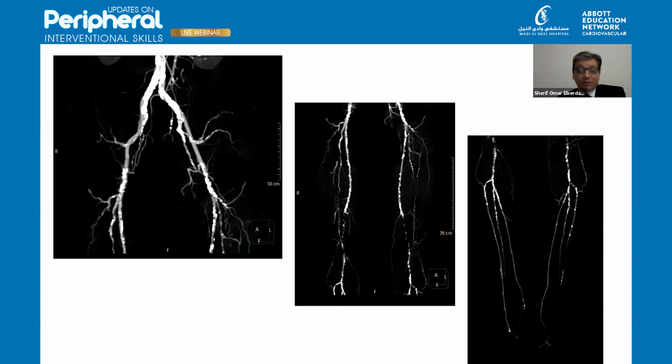Regarding the transbrachial approach, mainly the transradial approach in our intervention is not that applicable, especially for distal SFA and P1 segment, because we don't have such long tools to go through a transradial approach. But the transbrachial approach is very applicable, and we use it a lot in this kind of situation. But regarding this kind of patient, who had a CABG, a left transbrachial approach is questionable in those types of patients. So we have to ask the patient about the details of the CABG procedure he had, and which type of artery was used for the CABG.